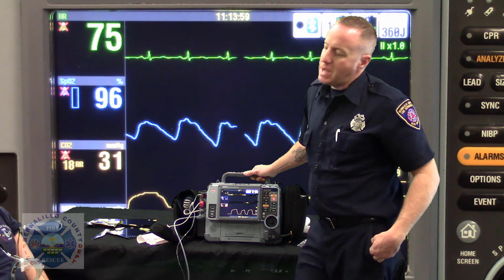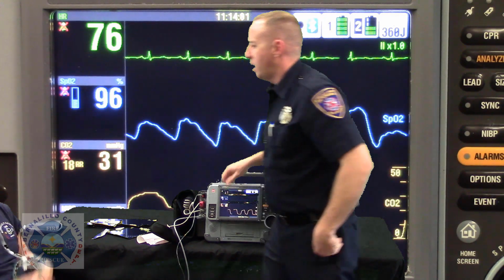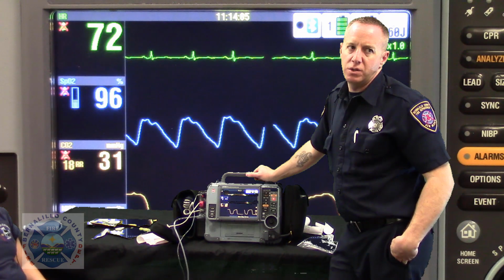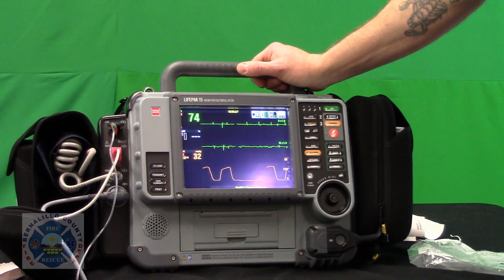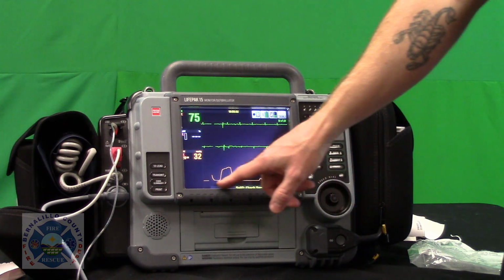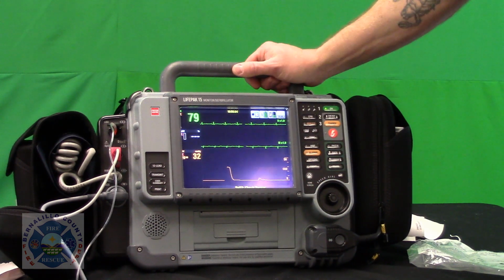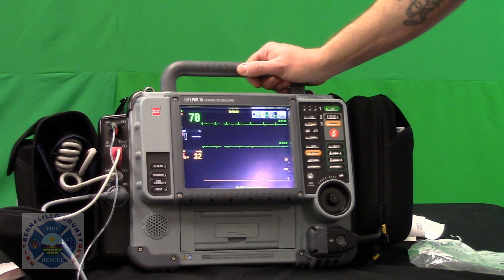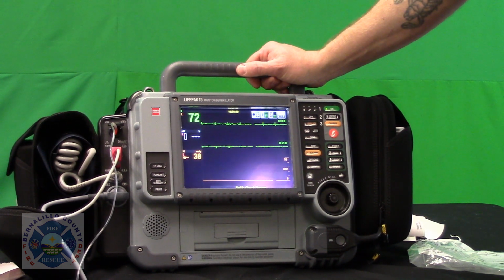If the patient were to stop breathing, then you can just take that off. The monitor is really quick to let you know that you've had a change in the patient's breathing status. Notice how we went from a waveform to no breathing whatsoever. And it's going to say here in a minute, we have a problem, reevaluate your patient. And that comes in the form of an apnea alarm.